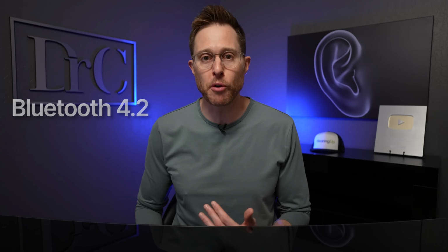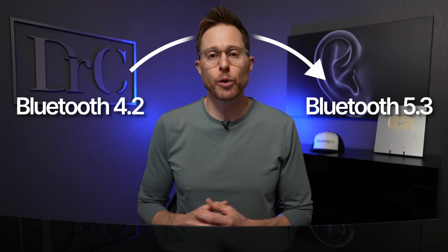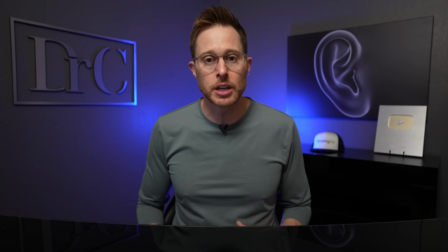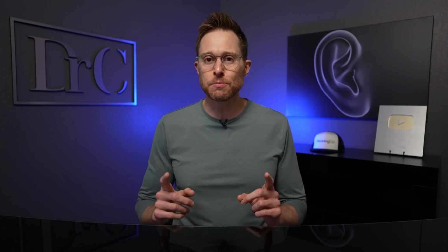Phonak has upgraded the Bluetooth version from 4.2 to 5.3, which effectively doubles the distance of transmission with these hearing aids using Bluetooth Classic. While this will not significantly improve the audio quality of streamed audio for media, music, or phone calls, it does mean that these hearing aids will be able to receive a firmware update to get you up to LE audio when it becomes more ubiquitous.